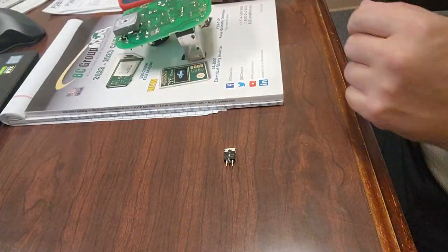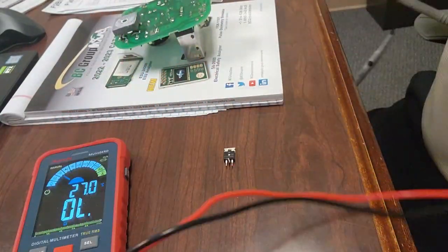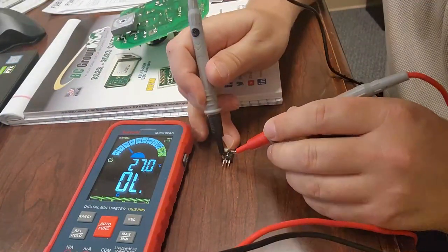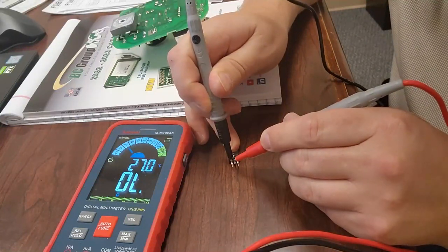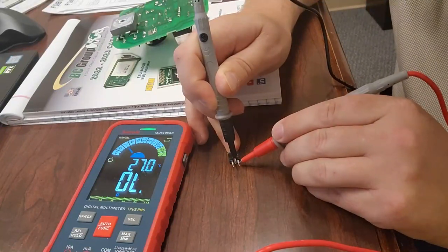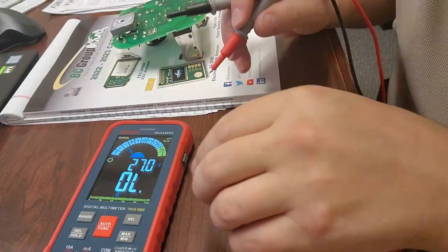So here we go. Here's my meter. Let me go ahead and flip my leads around so that you guys can see the meter. Now, right now I'm in continuity mode. So let's go ahead and touch the first leg and the middle. You can see I've got nothing. Let's switch it around. I've got nothing. Now let's try these two. Dead short, reverse, dead short. Okay, so there's something going on there.